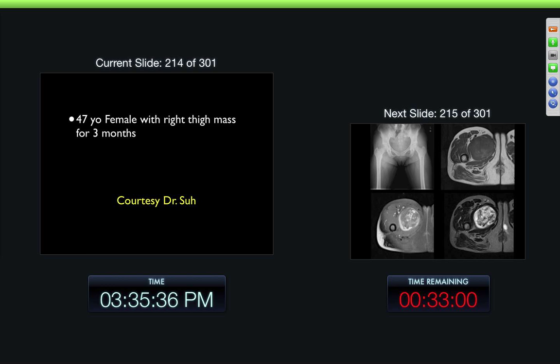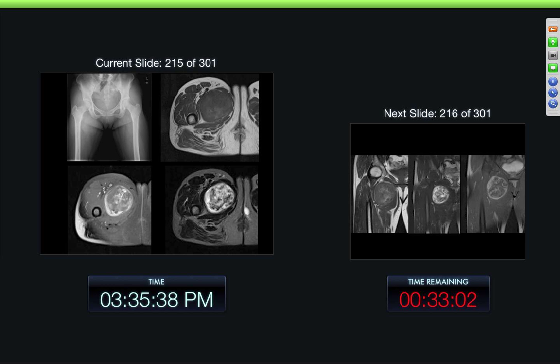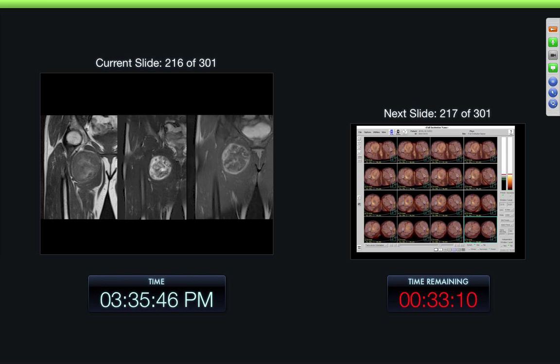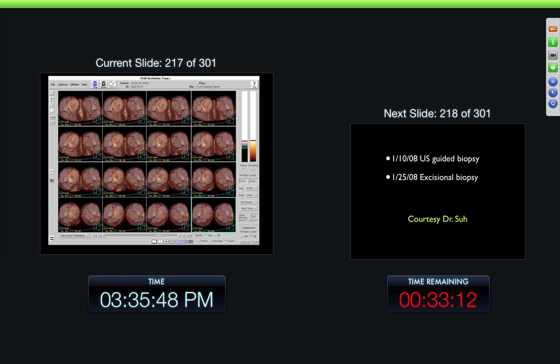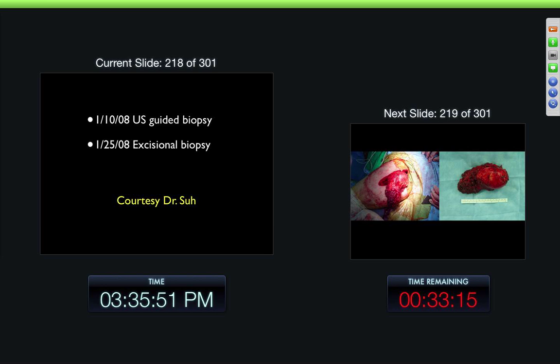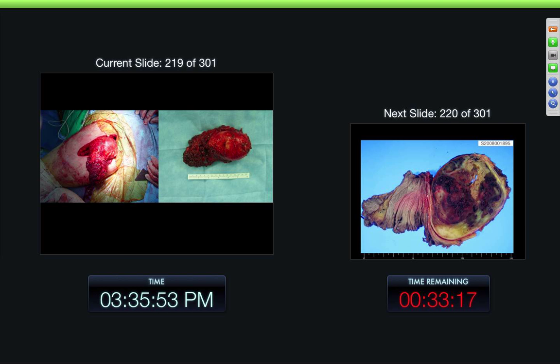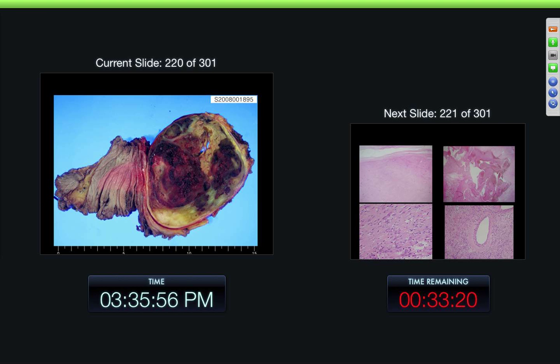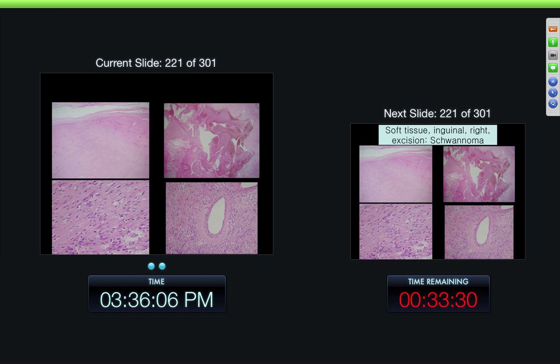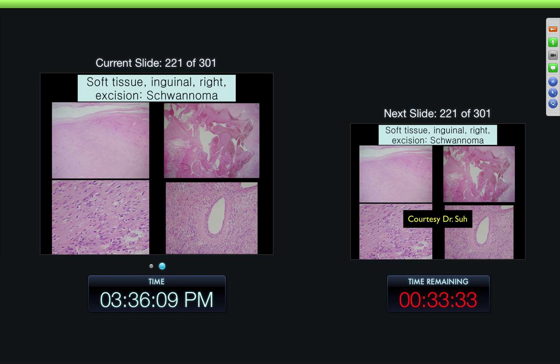47-year-old female with the right thigh mass for three months. Here we can see the mass markedly inhomogeneous — maybe a little high signal intensity on the T1-weighted images. We can see it in the thigh area with a little bit of uptake on the PET. Biopsy — there's the mass removed. A lot of inhomogeneity on the gross specimen, large areas of hemorrhage and some internal breakdown. Different areas had different pathology. And this was a large schwannoma in the thigh.